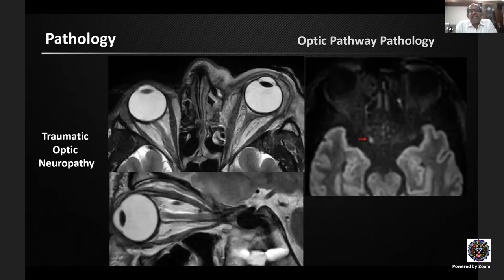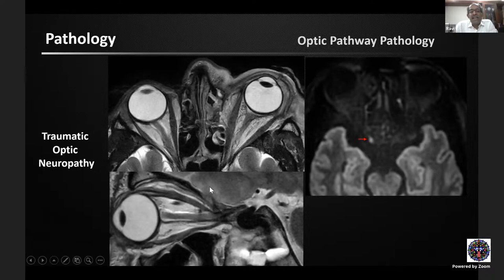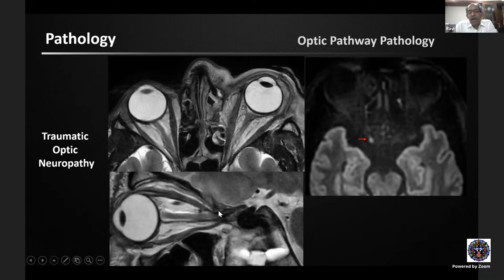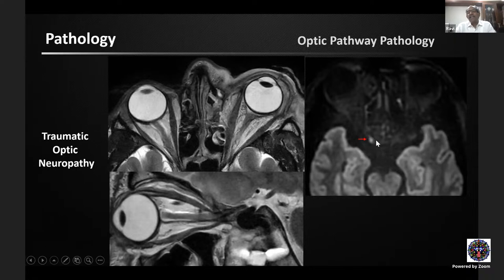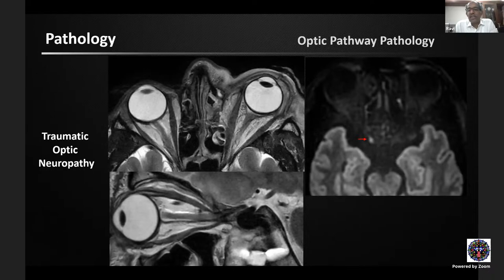In trauma, CT is the initial modality of choice for fractures and bony injuries. However, MRI is more sensitive to optic nerve signal changes. This case shows traumatic avulsion of the optic nerve from the globe; another shows canalicular segment compression by a bony fragment with altered signal. In a third case where CT was absolutely normal, MRI showed a focal area of restricted diffusion in the intracranial optic nerve segment — indicating excitotoxic injury and a poor prognosis in traumatic optic neuropathy.